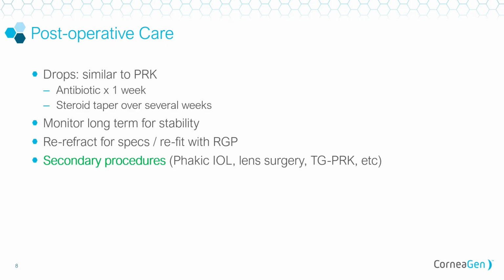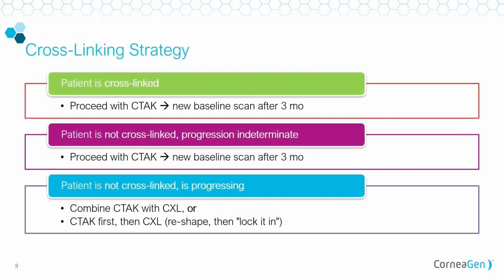Secondary procedures are also very, very useful. Phakic IOLs sometimes pair great with these patients. Lens surgery, toric IOL implantation, sometimes topo-guided laser. CTAK does not replace cross-linking.